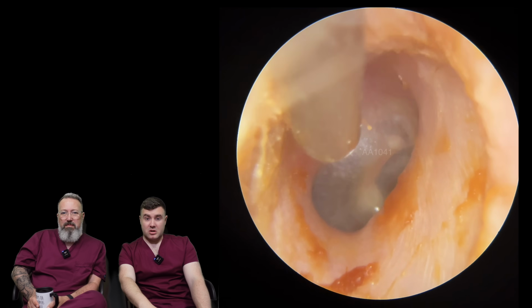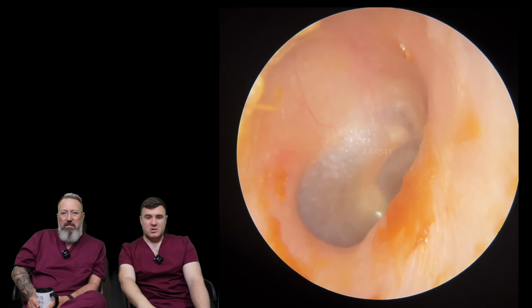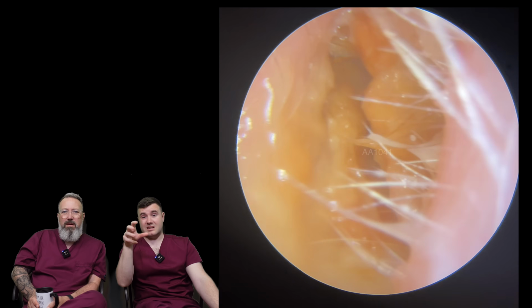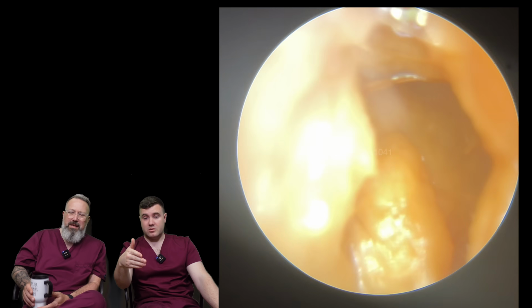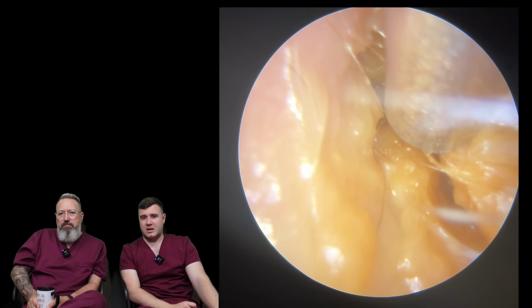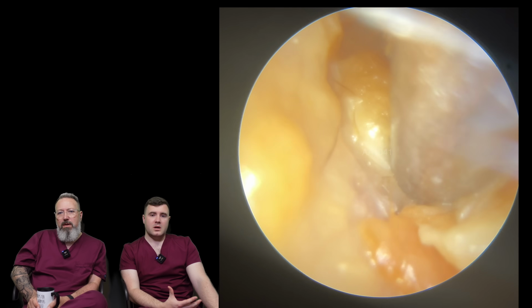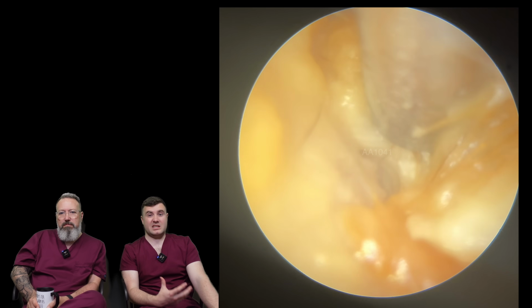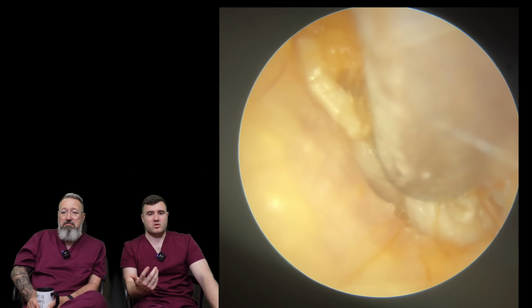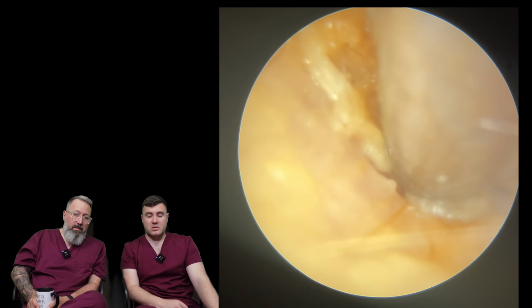We're just going to try and get some of these little pieces of dry skin away. And we're just going to recommend the patient stop the sodium bicarbonate and switch to olive oil if they want to use it regularly. We only generally tend to recommend sodium bicarbonate if we have to book the patient back in for a follow-up, or if they're actually just coming in for irrigation. We do get some patients that request a certain type of wax removal. But a lot of the time it's just olive oil that we would recommend.